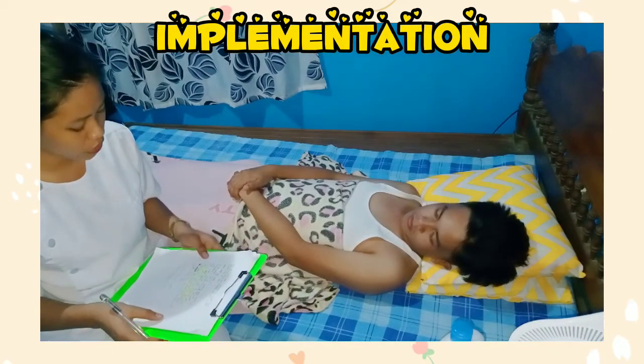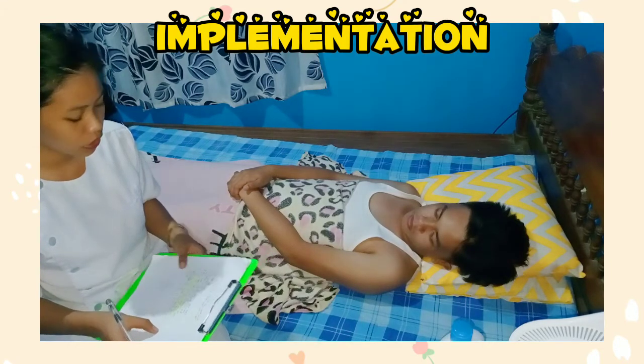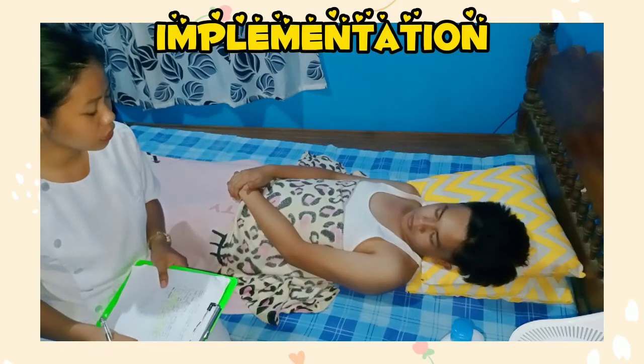So, Mr. Jorel, your body temperature is 36.2 Celsius and that's normal. So, thank you, Mr. Jorel. That's all for today.